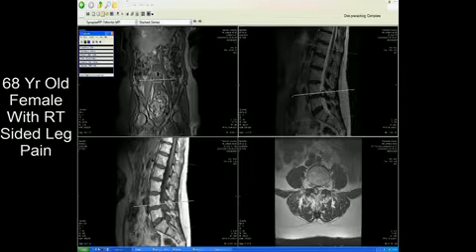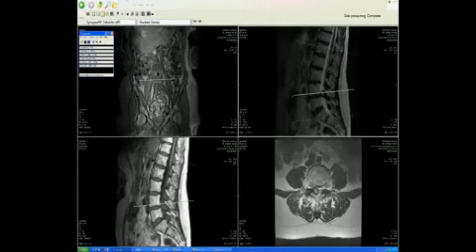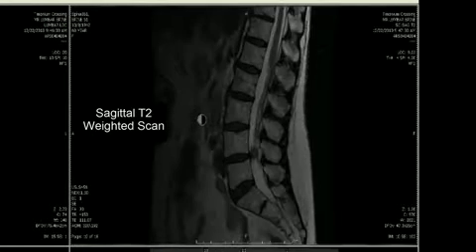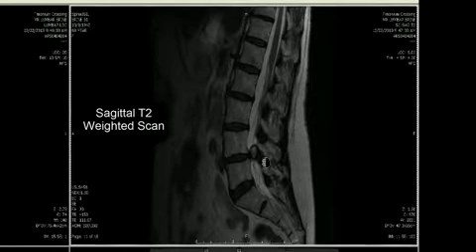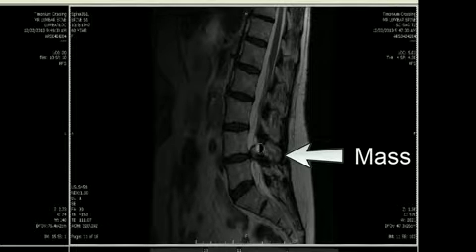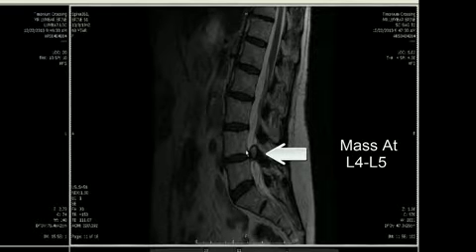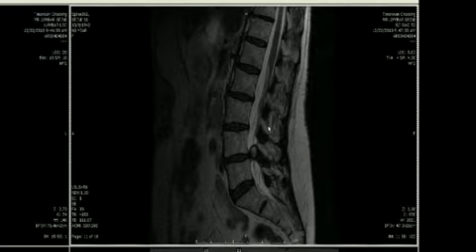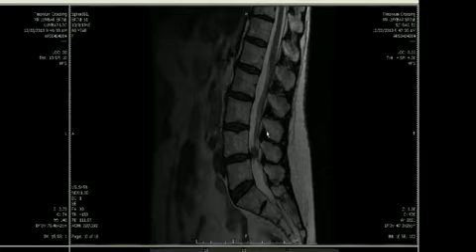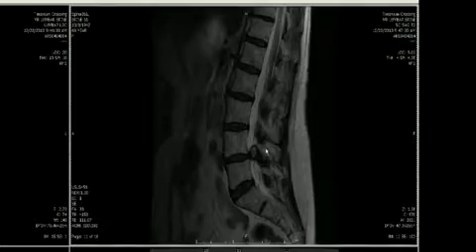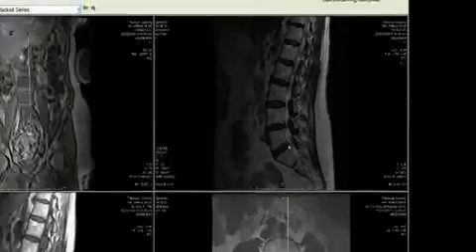This is a 68-year-old female who presented with right-sided leg pain. Starting with the sagittal T2-weighted scan, one sees almost immediately a mass which has bright signal intensity centrally but low signal intensity along the periphery, located at the L4-5 level. Looking at the lumbar spine, the discs don't look too bad — there's not much decreased disc signal intensity or indentation on the thecal sac. The patient has just one small annular fissure at the L5-S1 level.